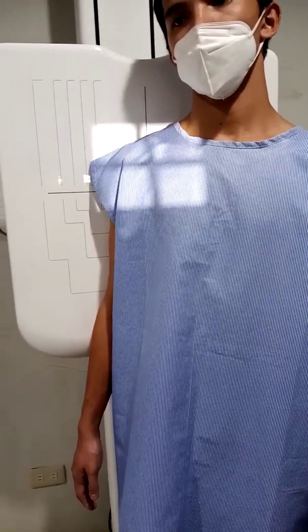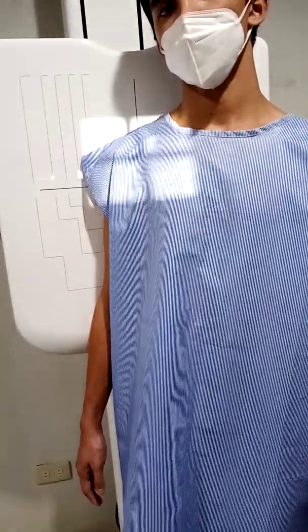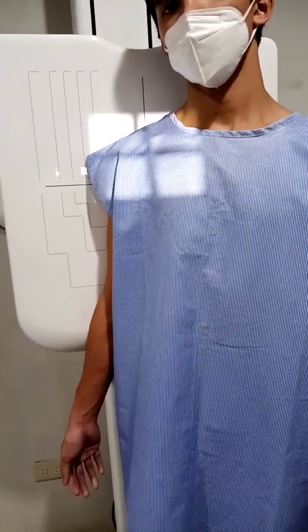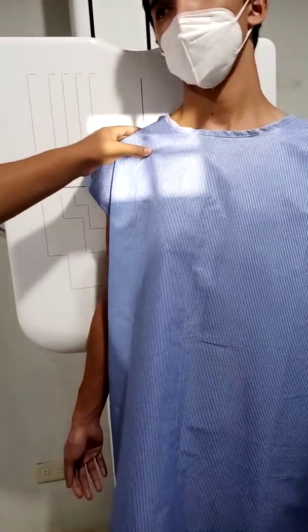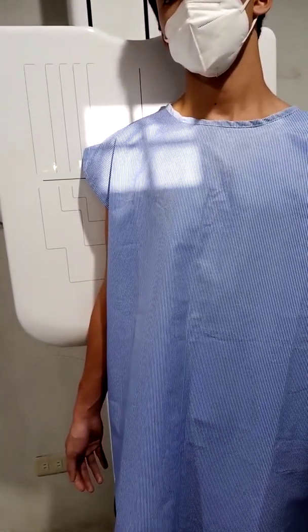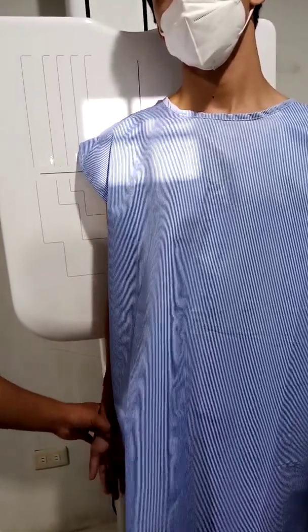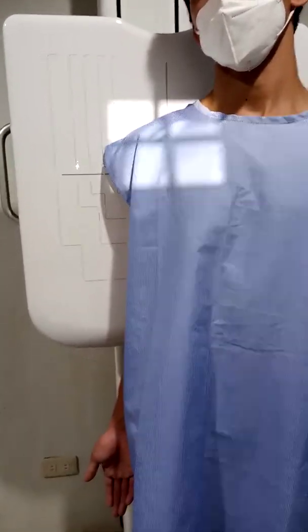And center the central ray. Perfect. That would be all.